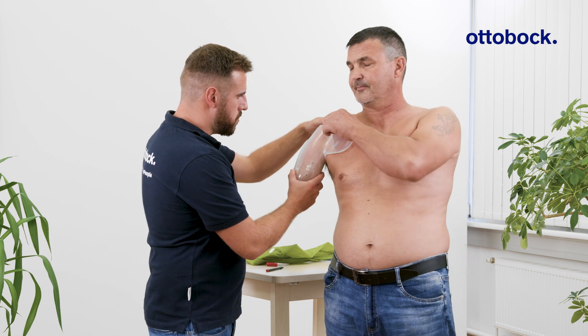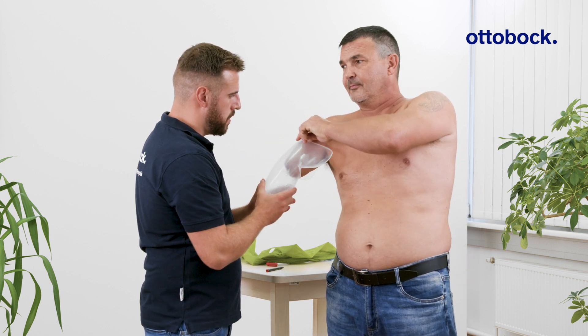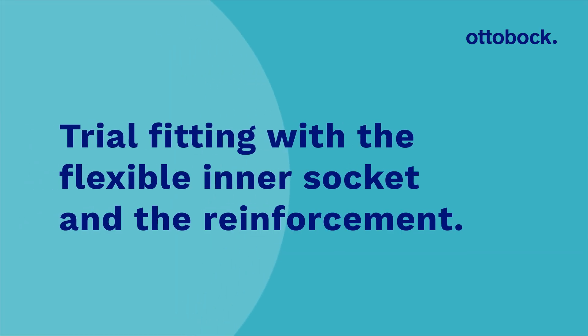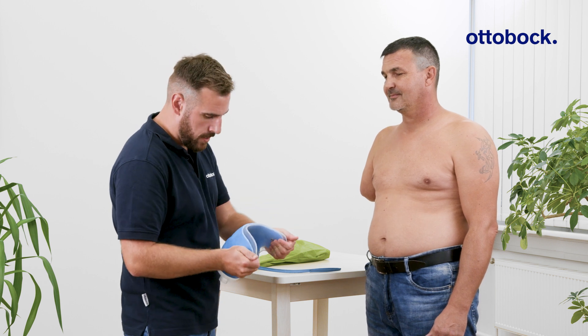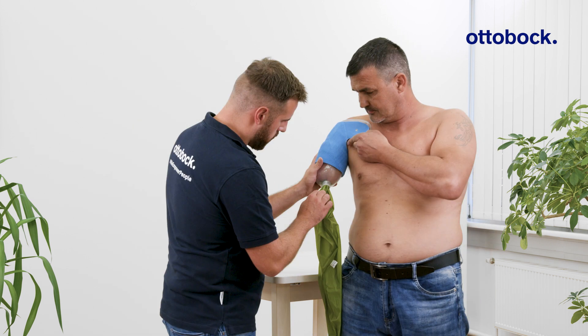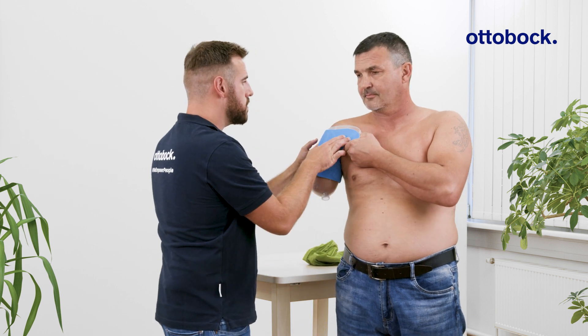Adjust the socket as needed and add the reinforcement made from synthetic casting tape. Reassess the fit to confirm comfort and stability.